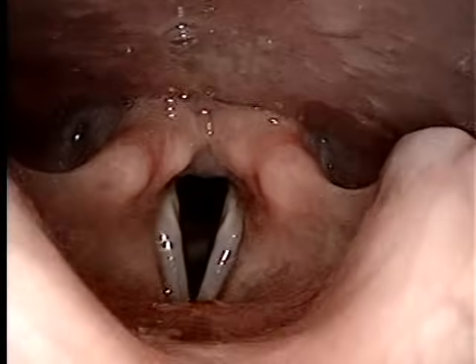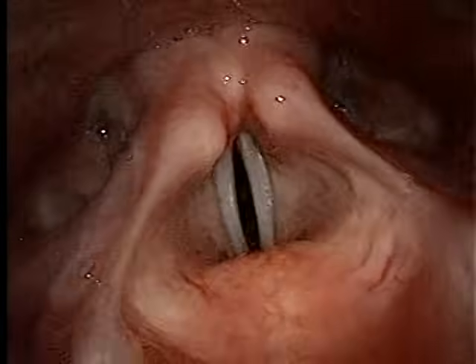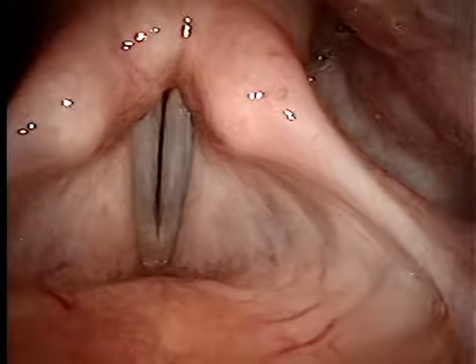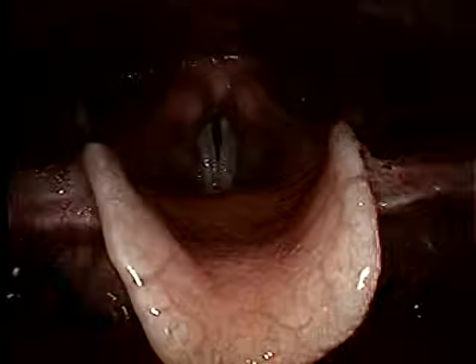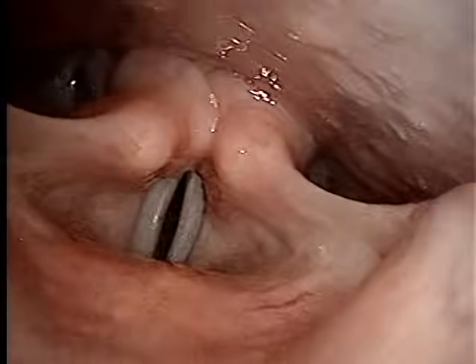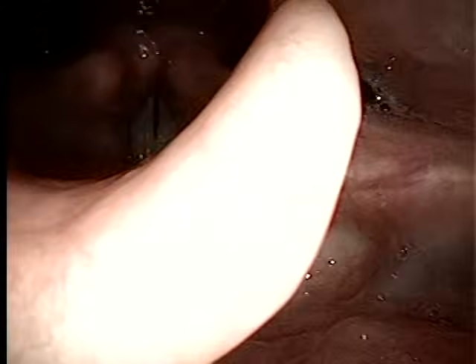Oh yeah, you can definitely see it a lot better. They definitely hit each other harder. It looks like they're really coming against each other. The closure is much more complete with the belt, definitely. I'm impressed.